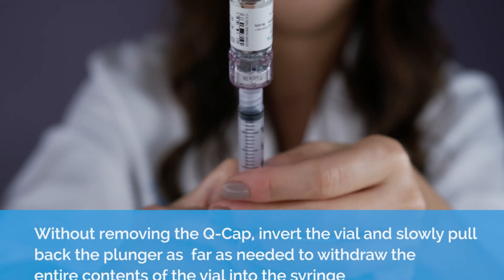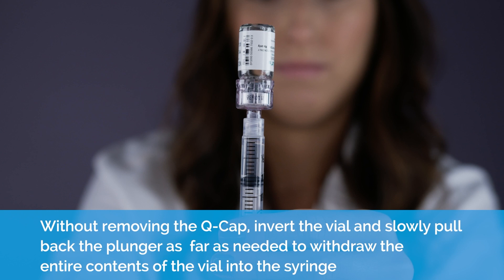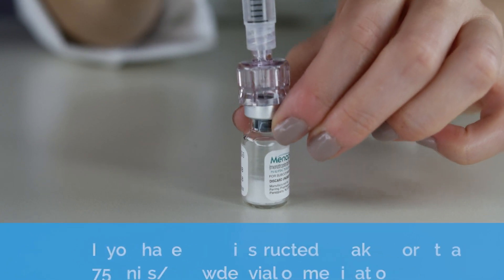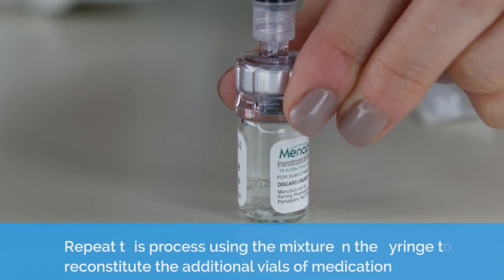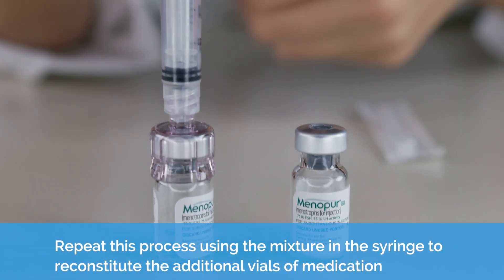Drawing up. Without removing the Q-Cap, invert the vial and slowly pull back the plunger as far as needed to withdraw the entire contents of the vial into the syringe. If you have been instructed to take more than 75 units or one powder vial of medication, repeat this process using the mixture in the syringe to reconstitute the additional vials of medication.